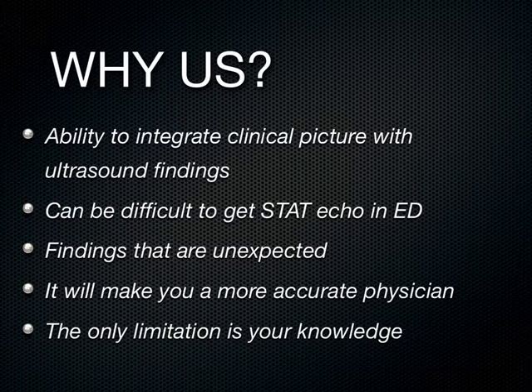And so this was an undifferentiated patient. The medical student just happened to be scanning, going bed to bed, and picked up that finding. Two days ago, would that have been discovered with a thorough history and physical? Maybe, maybe not.